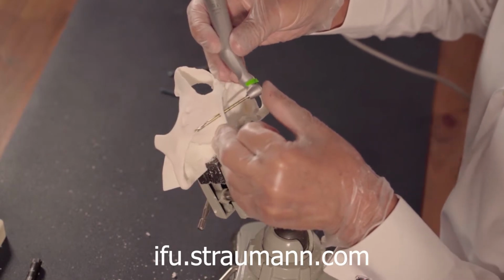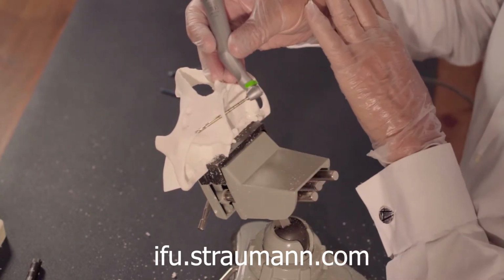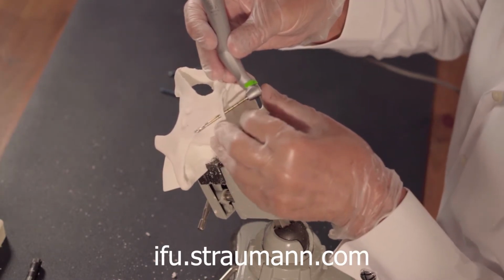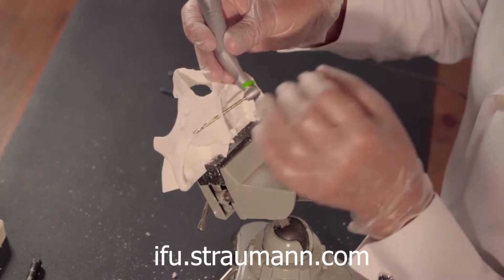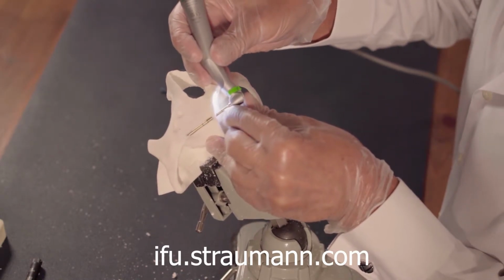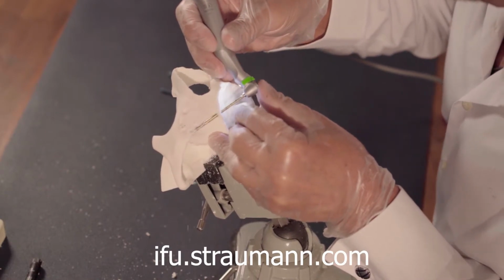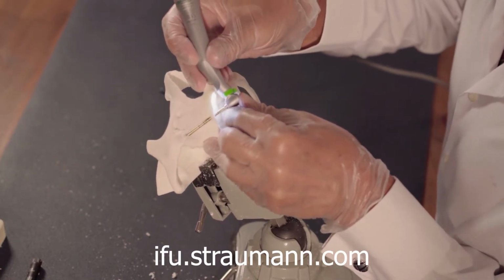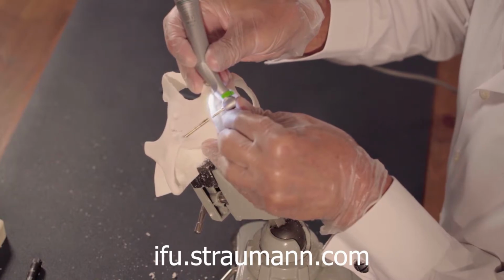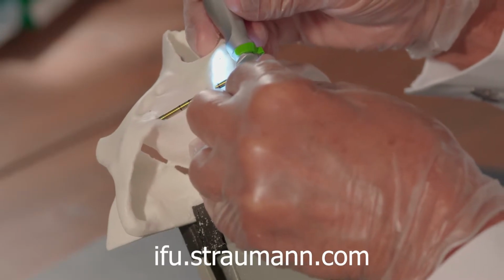You may observe my thumb is making the pressure, my right hand is maintaining the direction. Direction is fundamental. You shouldn't change direction. So pressure is with my left thumb, direction is with the right hand. Always use it.